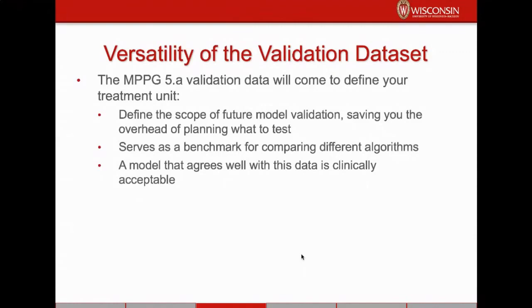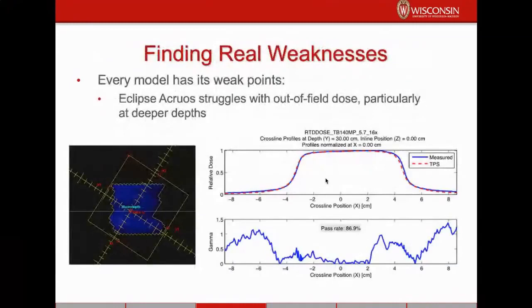And so this validation data set that you've measured constitutes a way of assessing if you have a clinically acceptable dose calculation model. So this particular set of data that you only have to measure once per machine can do a lot of work for you and save a lot of additional work in the future, as long as you document it well and are smart about reusing it.